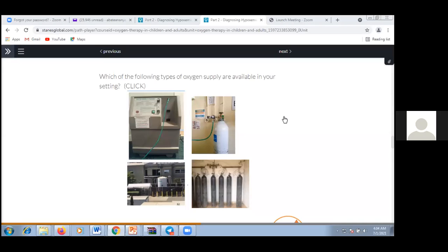That is better, right? So having an oxygen source through a pipeline system from a central source, from big tanks it could be, or from cylinders arranged in series. But an oxygen plant is something which really needs a lot of investment, and I think we're heading to that.